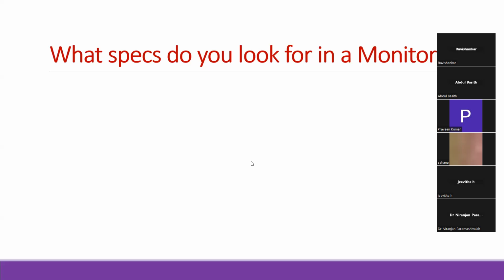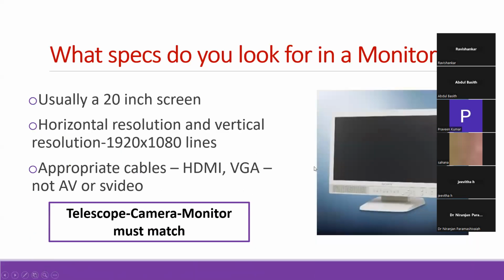Next, what else should you have in the monitor? To record, we need a... You need an output from the monitor, okay? Yes. An input and output. Yeah, what inputs do you need in a monitor? One from the video, yeah. One from the camera. Yeah. And that's also one from camera input. Yeah, you need to have more than one input. All right. And definitely you need to have an output from there, perhaps more than one.